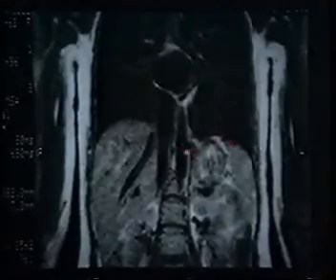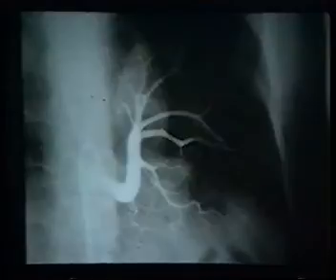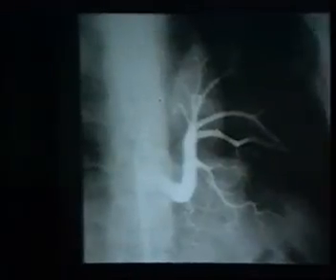And if we look carefully, we can identify the anomalous vessel arising here just above the diaphragm. You may not see very much more than this, frankly, because these vessels can be tortuous. They can go in and out of the plane. But if you recognize this much in association with the kind of mucoid-impacted airways I've shown you on MR, that is a definitive diagnosis.